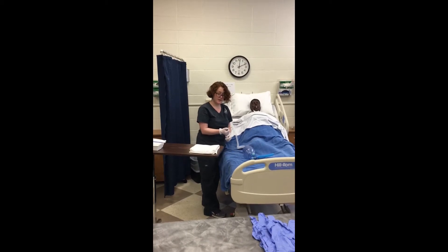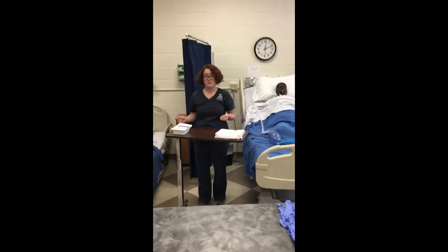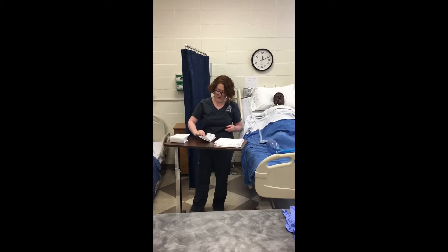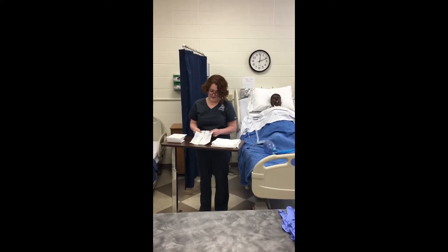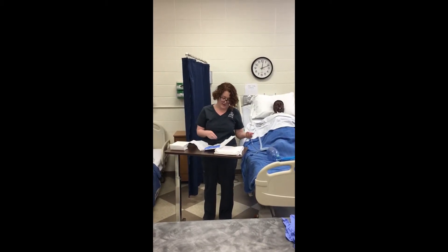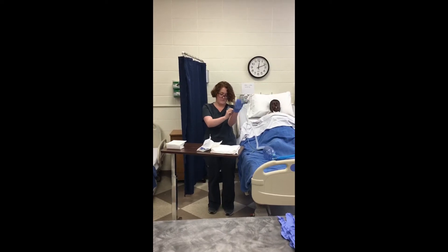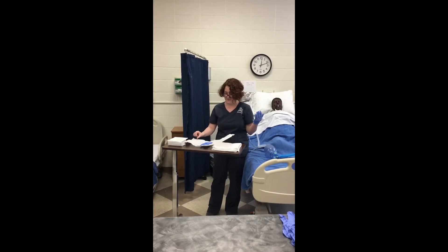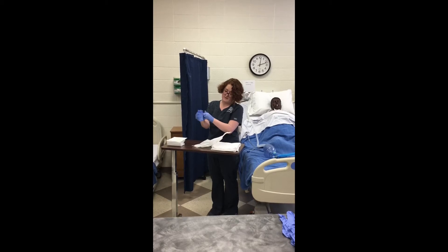I'm going to test the suction — it's working. I'm going to remove my clean gloves, perform hand hygiene, and then open my sterile kit away from me. I'll remove my sterile gloves and apply them, being careful of the one-inch border on the inside. I'm going to glove my non-dominant hand first, making sure I only touch the inside one-inch border, then don my dominant hand.